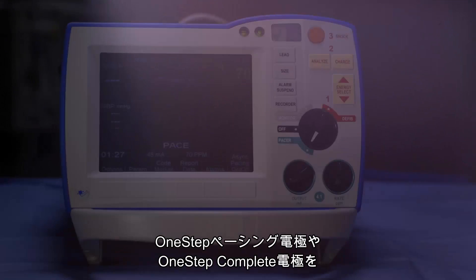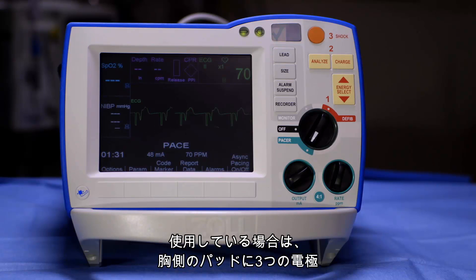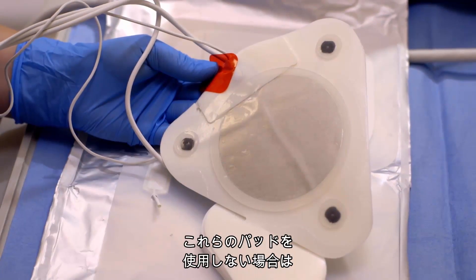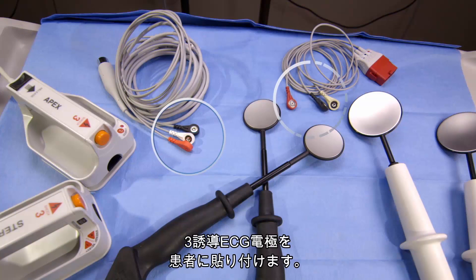Pacing. When the R-series is used with the one-step complete or pacing electrodes, a separate ECG cable is not required because the three leads are built into the front electrode pad. If these electrodes are not used, you must first attach an ECG cable to the device and place the three lead ECG electrodes on the patient.